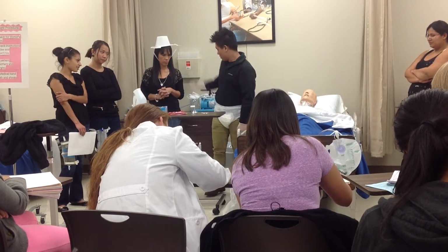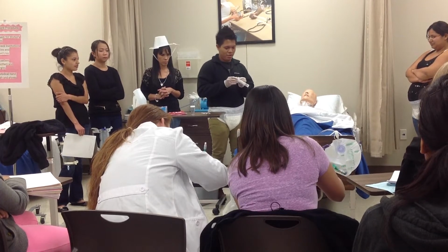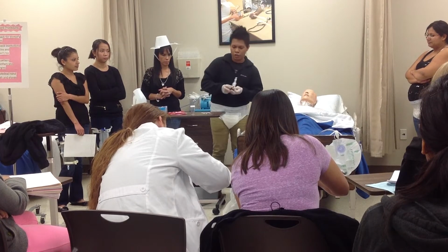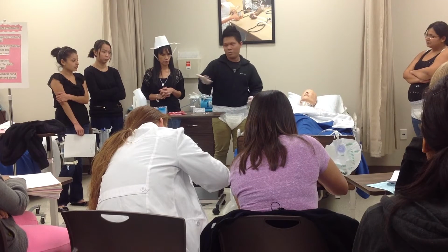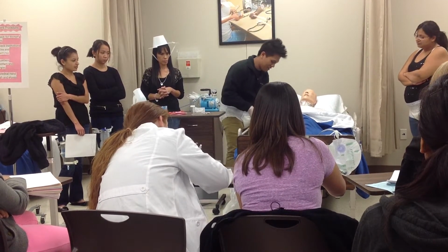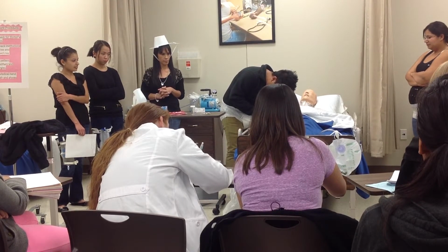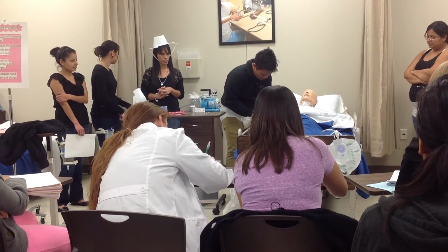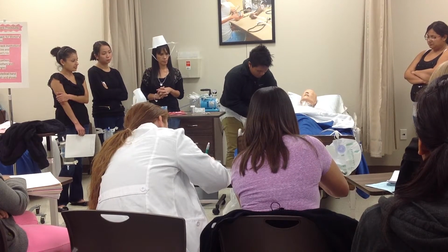Then get your syringe. Open it. Okay, make sure you have the 10 ml syringe. And it says in the doctor's order that we need to get 10 mils of specimen. So we're just going to go ahead and stick the syringe in there and twist it on. Okay, and so it's in there. So we're going to go ahead and aspirate 10 mils of the specimen. Then we're going to go ahead and take that off.